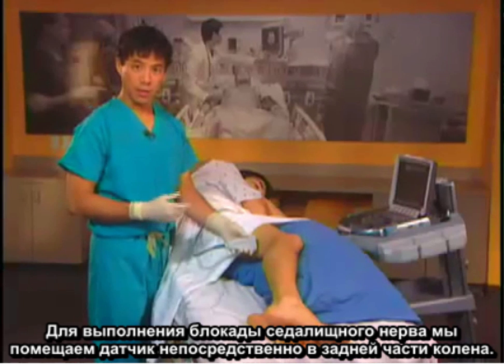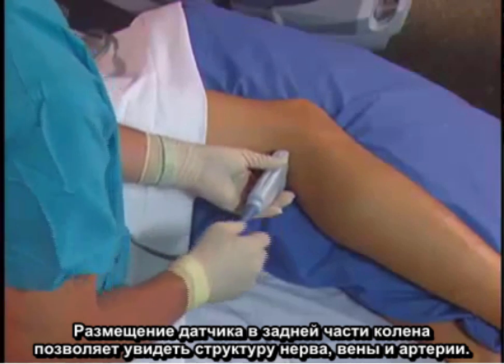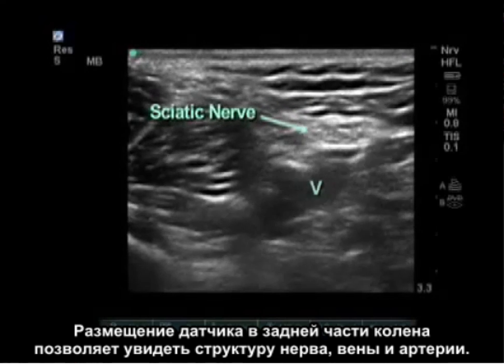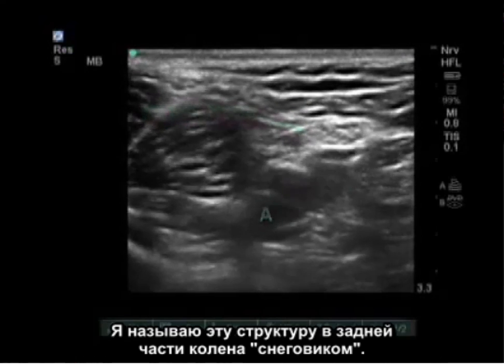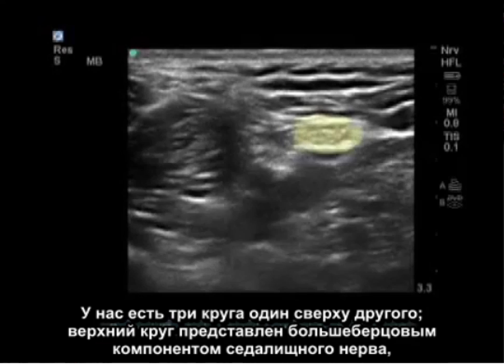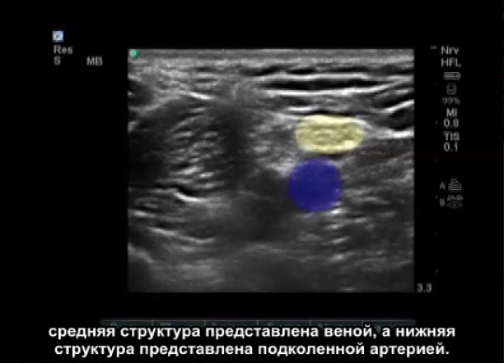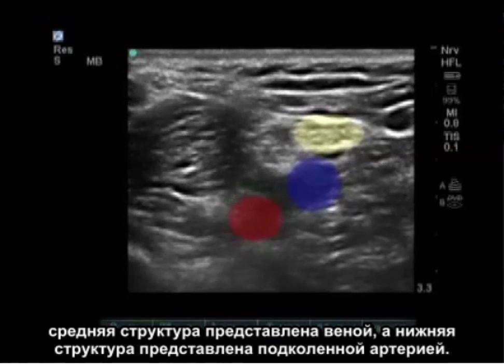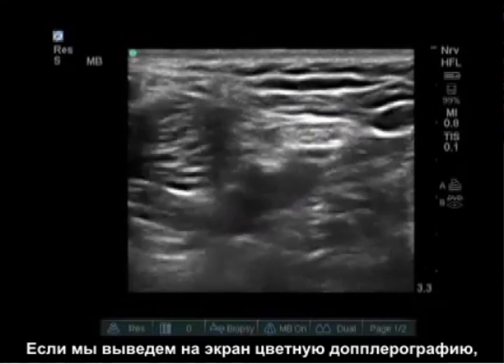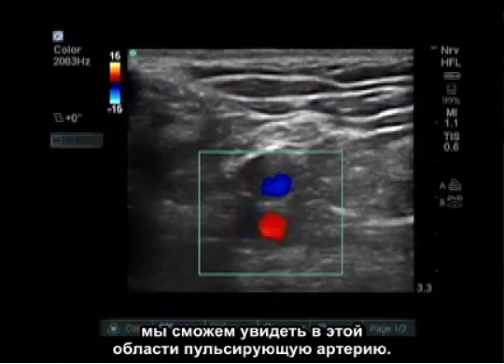To perform the popliteal sciatic nerve block, we put the probe directly in the back of the knee. Placement of the probe there reveals the nerve, the vein, and the artery. I call this structure the snowman in the back of the knee — three circles on top of each other. The uppermost circle is the tibial component of the sciatic nerve, the middle structure is the vein, and the deep structure is the popliteal artery. Using color Doppler, we are able to see the pulsating artery in this area.